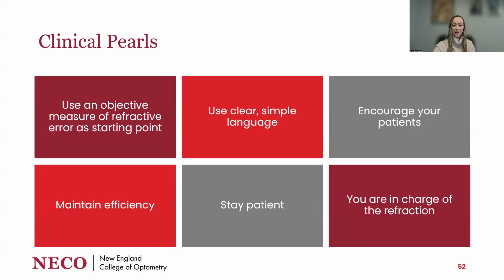They might both be blurry. Our goal here is to get the one that is the most clear. And it's okay for them to look the same. A lot of patients think that the same is an incorrect answer, or that they're not going to get the most accurate prescription if they don't tell you one or two. So encourage your patients. Let them know the same is always a good answer, and always remind them that it is a choice before starting your refraction.